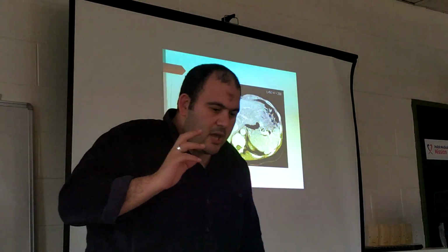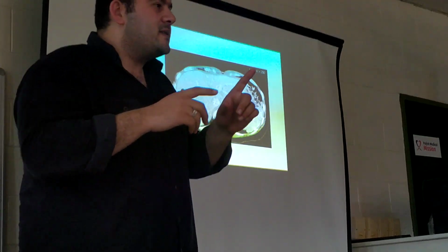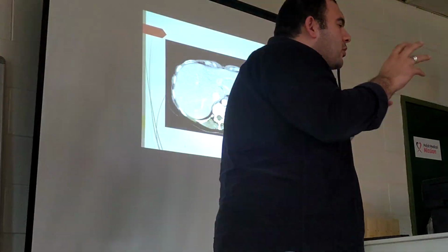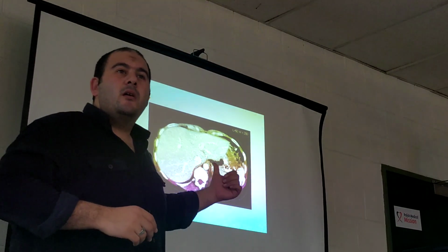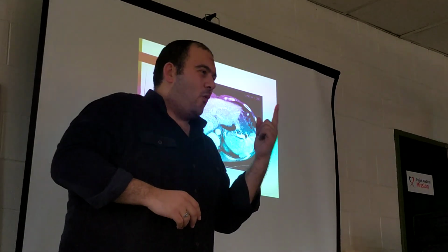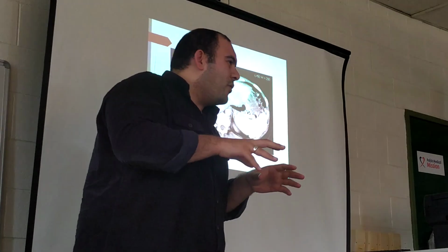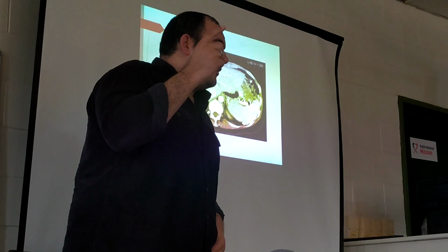If our body is composed of one material or one density material, all bone, soft tissue, fluids, or fat, all components having the same density, you can imagine the image will be like this. The CT image will be only one color, because all components or all tissues inside our bodies will absorb the radiation with the same intensity. You will find here different components inside your body.